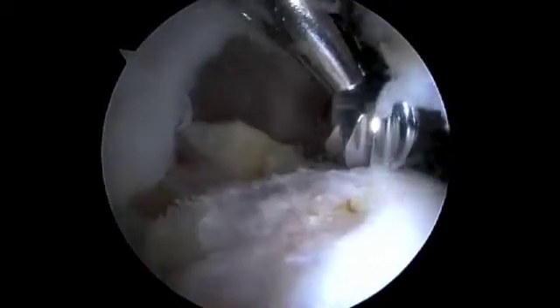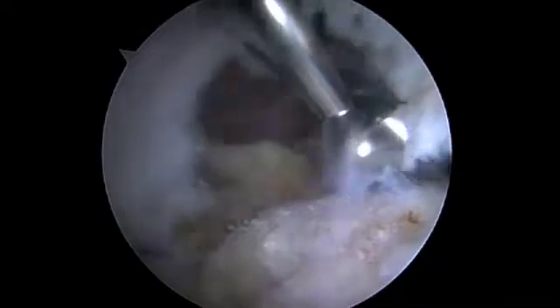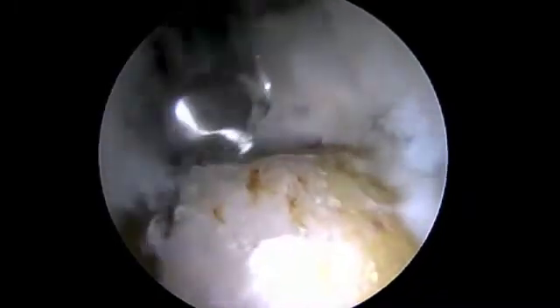With the hip still in flexion, the burr is then used to reshape the medial side of the head-neck junction. The CAM lesion is rounded out, taking very little bone on the femoral head side and removing more bone as we approach the trough. The hip is slowly brought out into more extension as we work our way more superiorly. It is important to get comfortable with manipulating the position of the hip to gain visualization of different areas of the CAM lesion when working through an interportal capsulotomy.